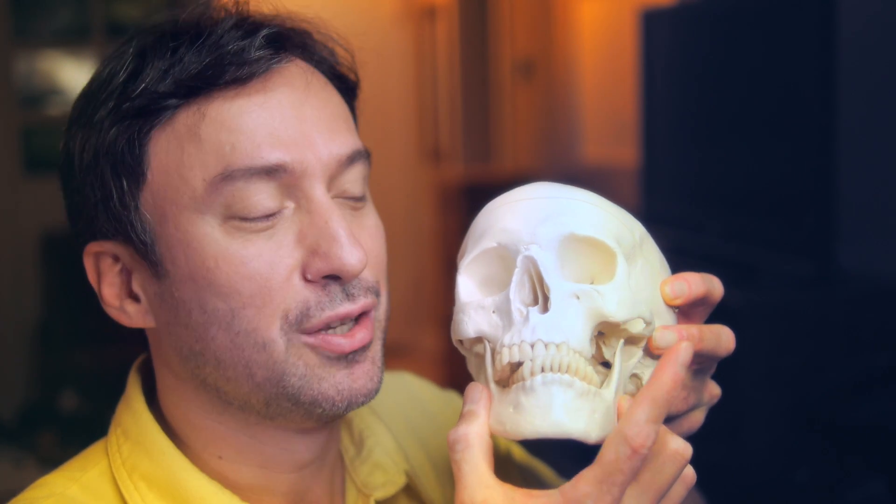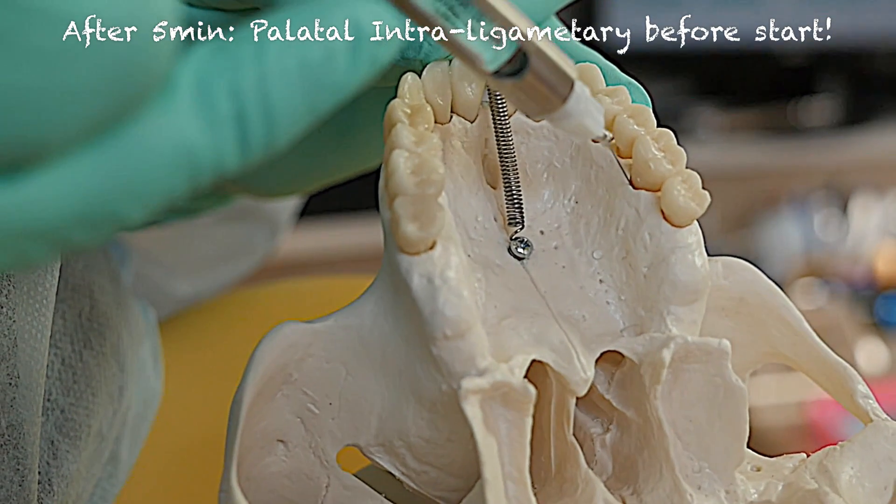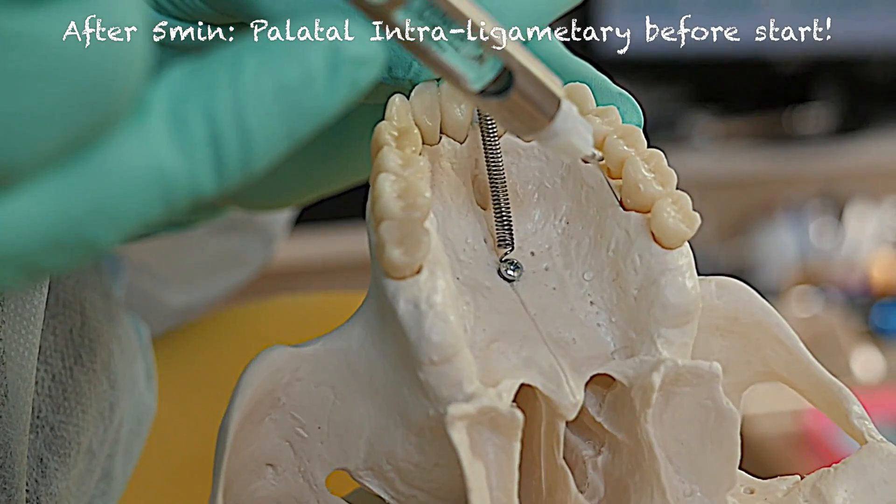So here's Ralph making the demonstration — injecting on the left side, you will have to have the lower jaw move to the same side in order to open the buccal shelf. If you need additional anesthesia in the palatal gingival rim in order to apply the rubber dam, then you can always deposit just a few drops of your local anesthetic just before you start the procedure.